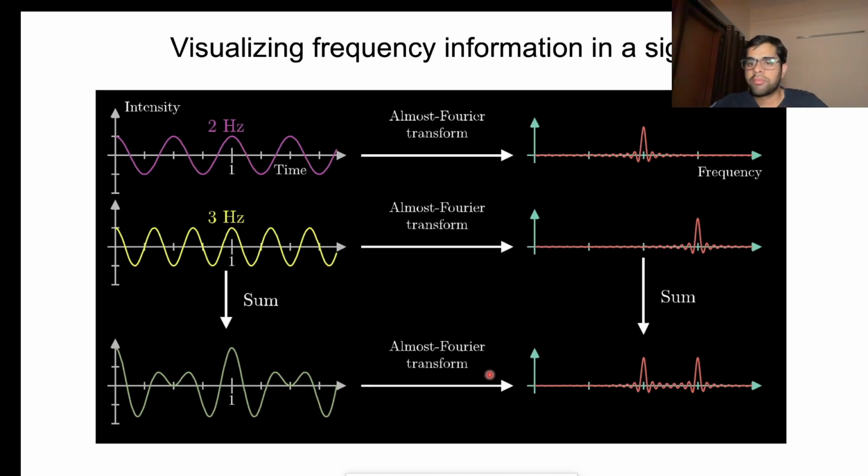Number one, and in the frequency domain, moreover, a single peak is being shown, whereas in the time domain we have many peaks and many valleys. So what's the meaning of this single peak in the frequency domain?